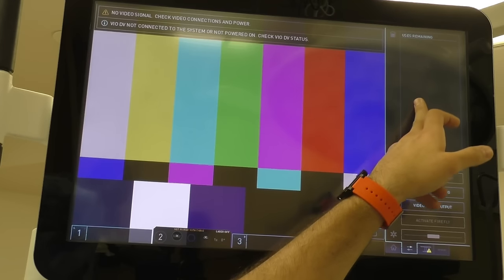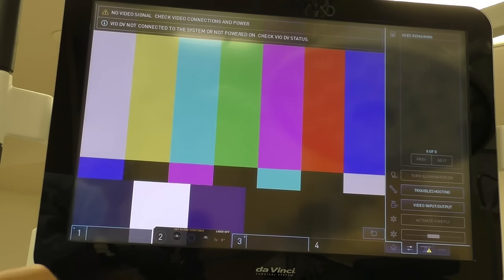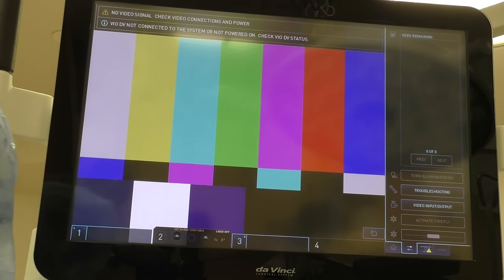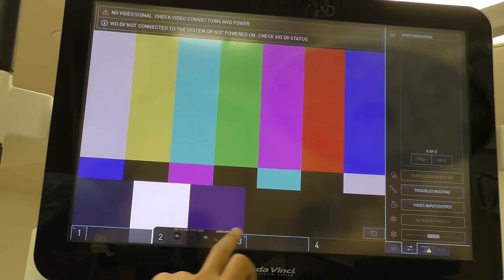You can make sure none of those instruments are expired or don't have any uses left. We like to keep a tally — when it starts getting close to maybe the last five uses of an instrument, we'll start putting little hash marks on the instrument itself just to let the tech know when they're opening it that it only has so many lives left.